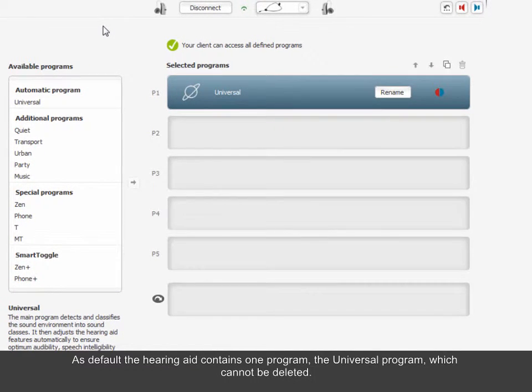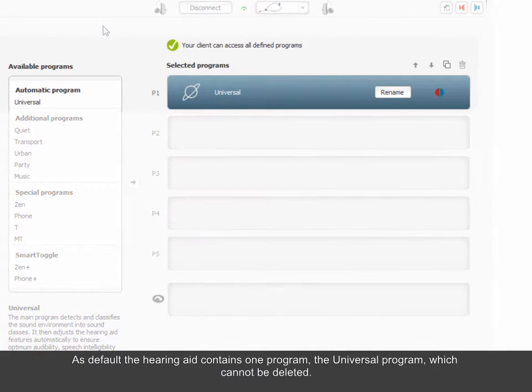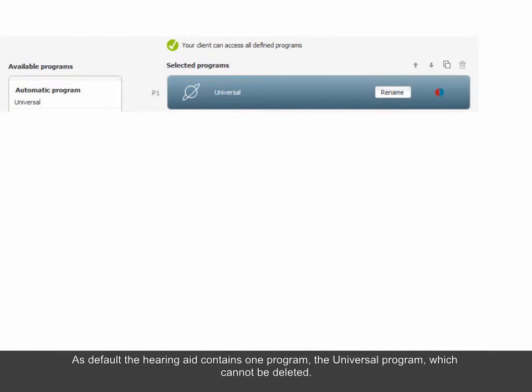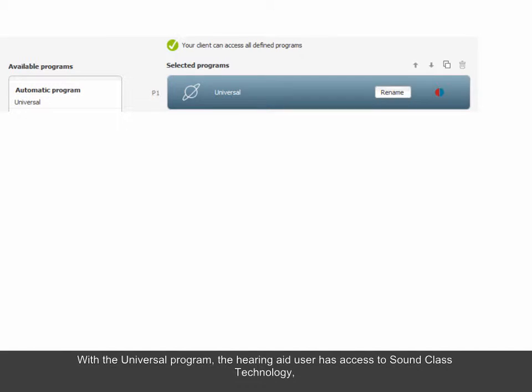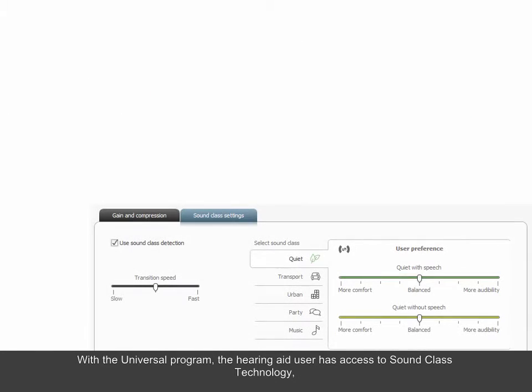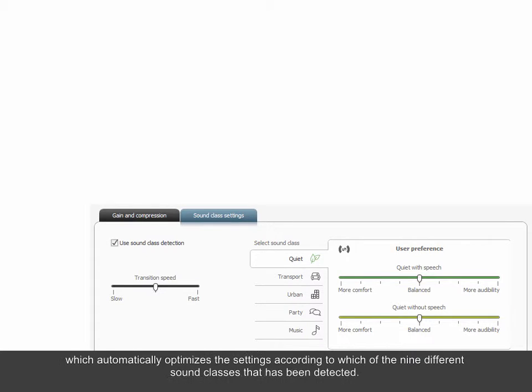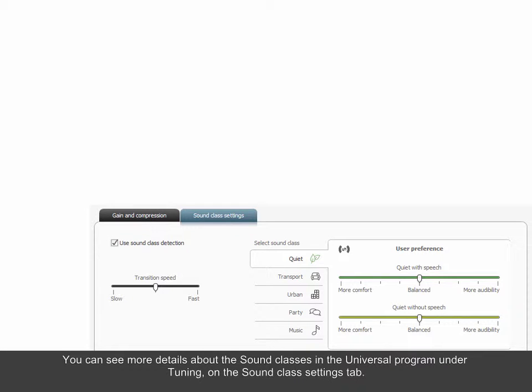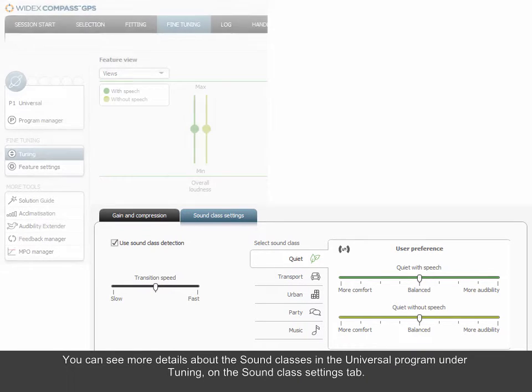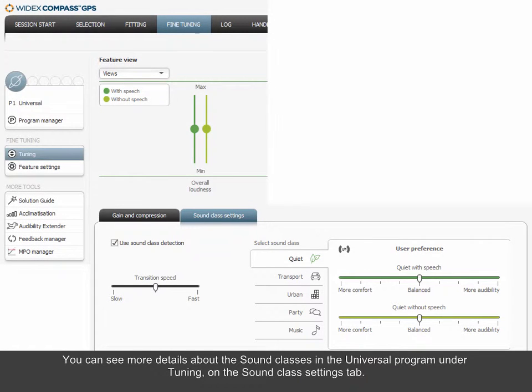As default, the hearing aid contains one program, the Universal program, which cannot be deleted. With the Universal program, the hearing aid user has access to Sound Class technology, which automatically optimizes the settings according to which of the nine different Sound Classes has been detected. You can see more details about the Sound Classes in the Universal program under Tuning on the Sound Class Settings tab.